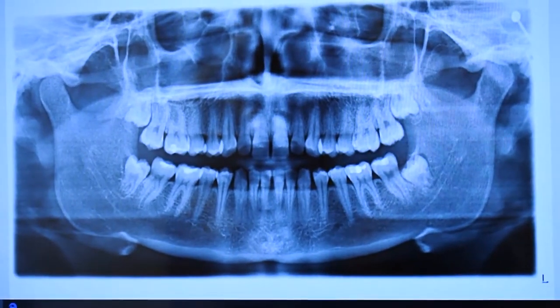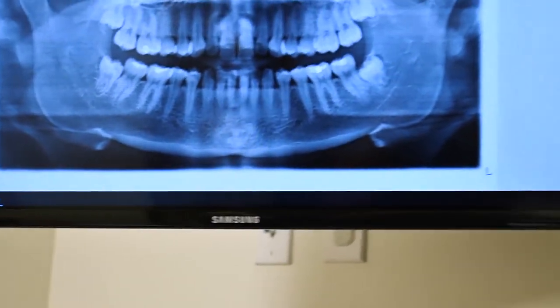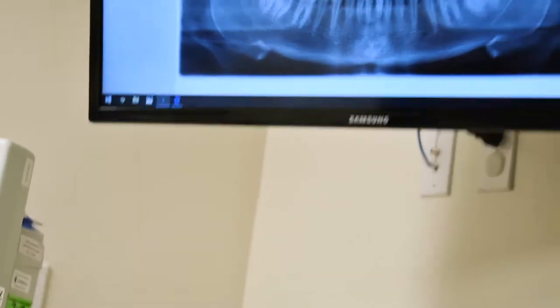We're going to get these teeth out today. Right now she's got some Versed and some Fentanyl, so she's just kind of getting sleepy. Stay tuned and we'll show you one tooth at a time.